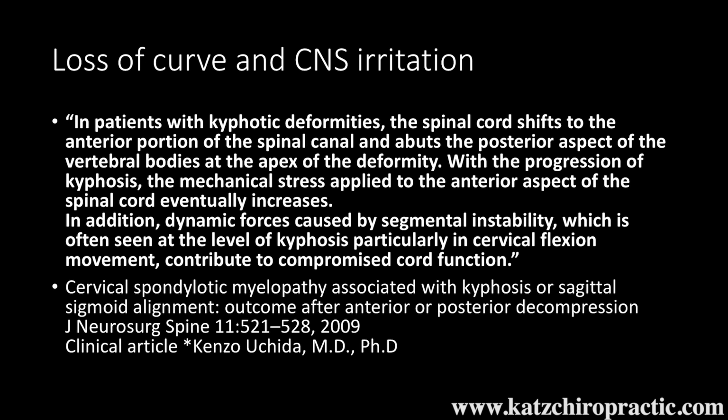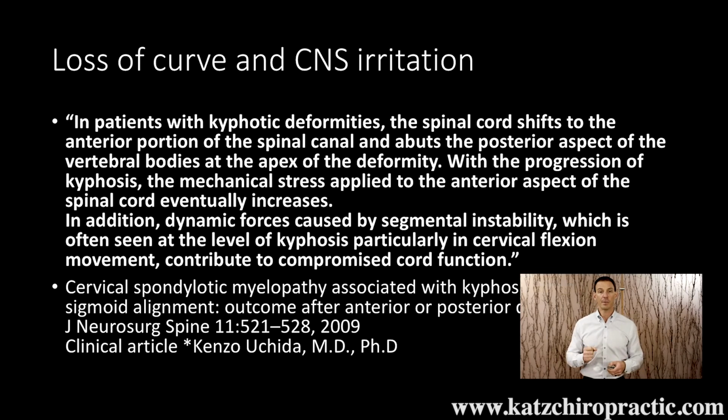Now, you have a loss of curve, big deal. It is a big deal. According to this paper here and many, many others, it can literally irritate your spinal cord. This is something we want to identify and something we can fix.